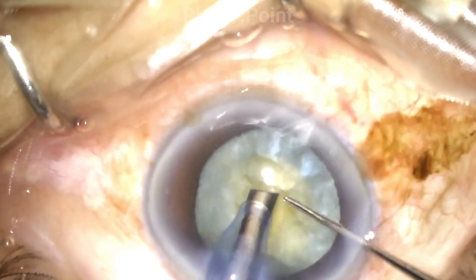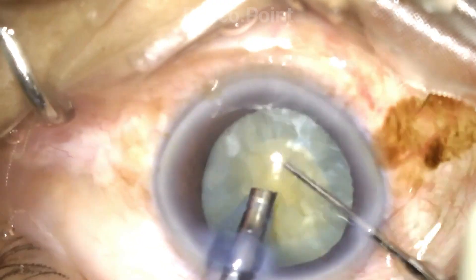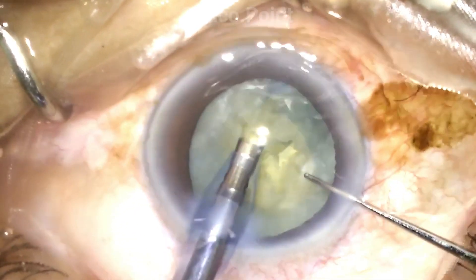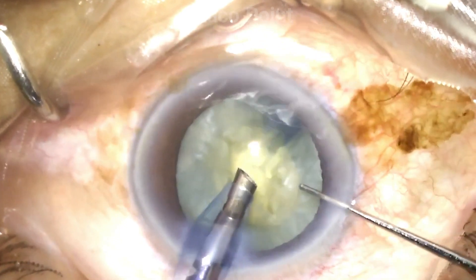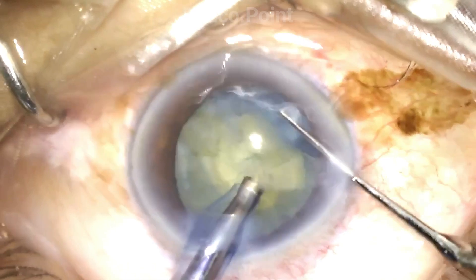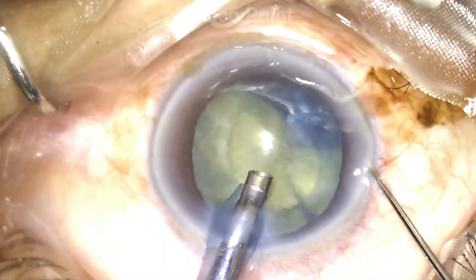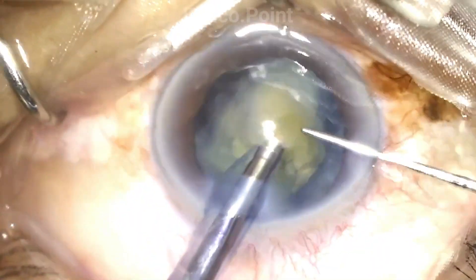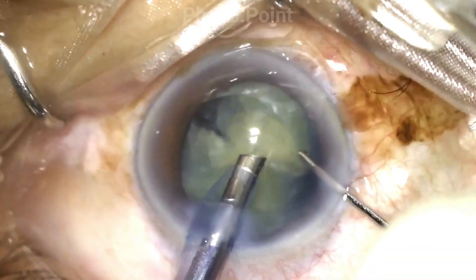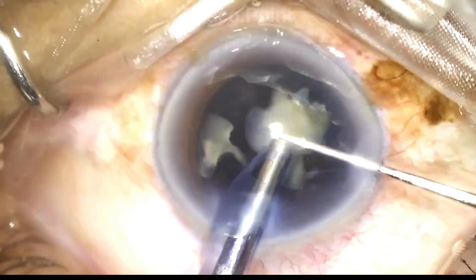In this case, as you can see, the cataract is a soft, mature cataract. The nucleus breaks down fairly easily into its emulsifiable fragments. The power required is not more than about 30%, the flow rate is about 30 to 36 cc per minute, and a vacuum of 280 to 300 is adequate to perform the nucleus management. One needs to be extremely cautious while bringing the fragments up and emulsifying them in the pupillary zone, as there can be accidental damage to the capsulorexis edge. Please note how during nucleus disassembly and emulsification, my instruments — the tip of the phaco probe as well as the chopper — always remain within the center of the eye, thereby protecting the capsulorexis edge from accidental injury.